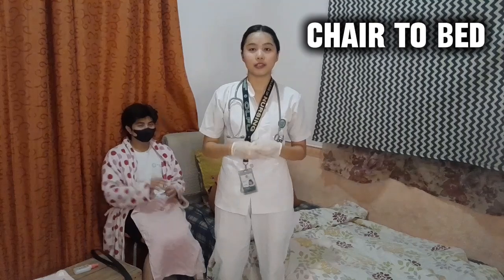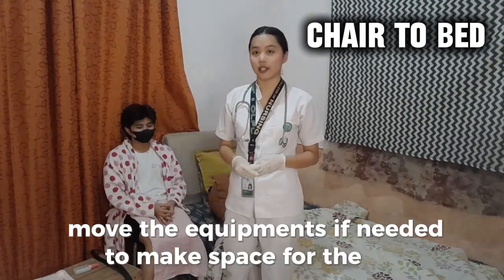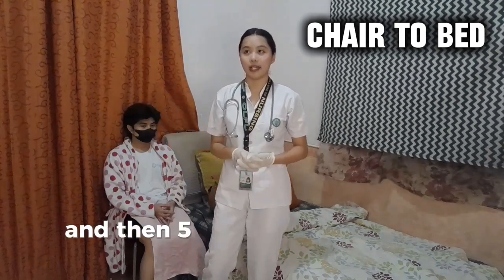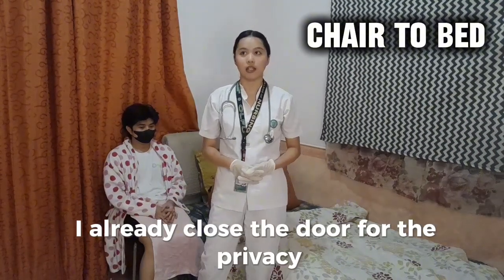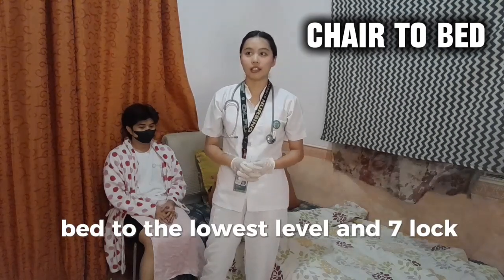Okay. Step number 4, move the equipment if needed to make space for the bed. And then, 5, close the curtains for privacy. Since we are in a private room, I already closed the door for privacy. 6, lower the bed to the lowest level. And 7, lock the bed wheels.